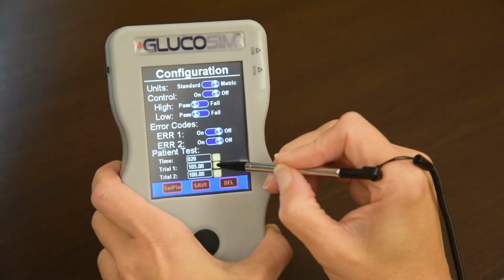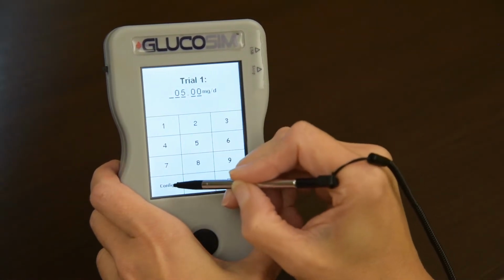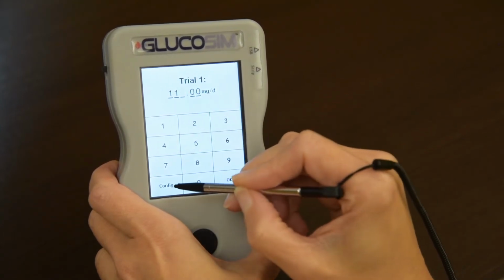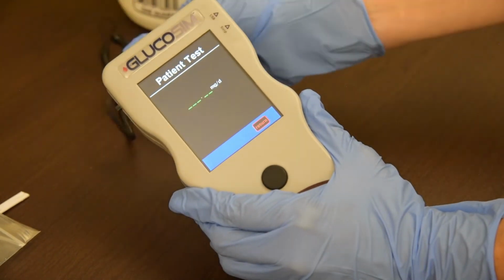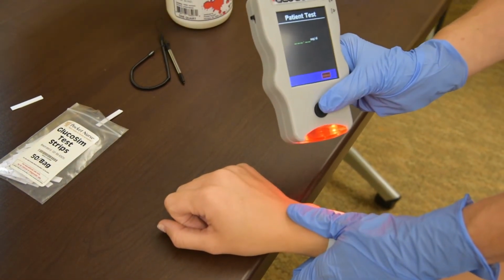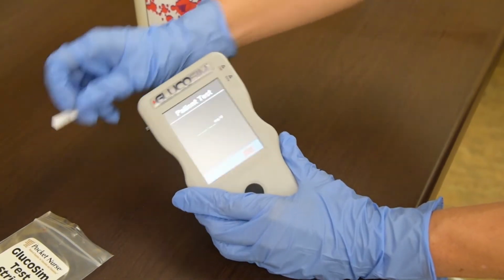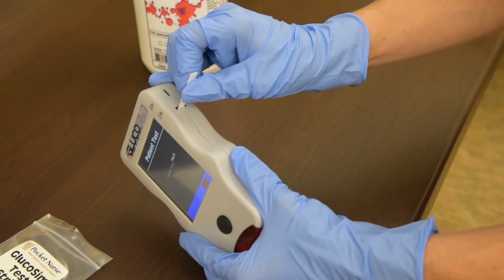To perform a simulated glucose test, first set your desired reading using the configuration screen. Then press Patient Test on the home screen. Simulate scanning a patient's ID, then simulate a scan of the test strip packaging. Prepare a GlucoSIM test strip and gently insert the strip into the slot on the right side of the unit.